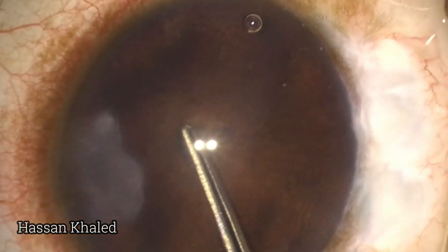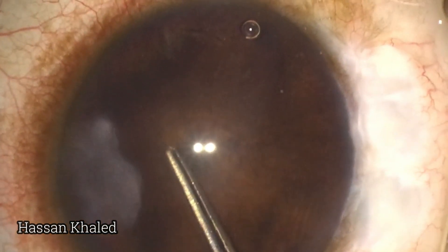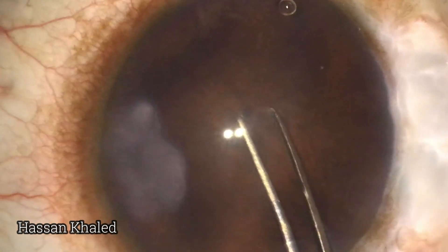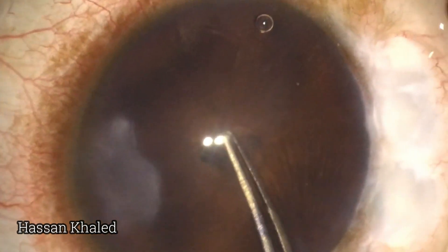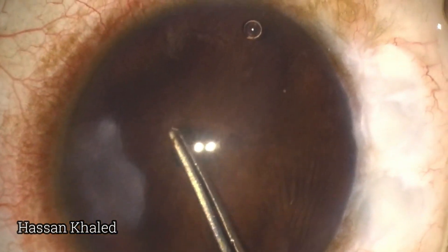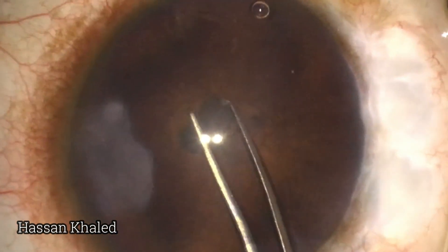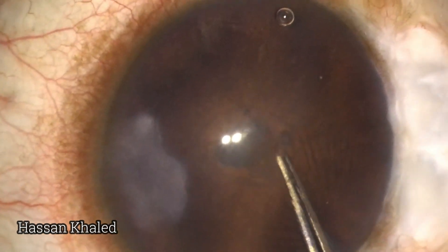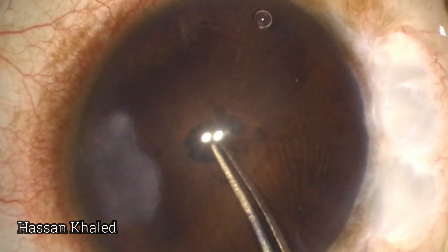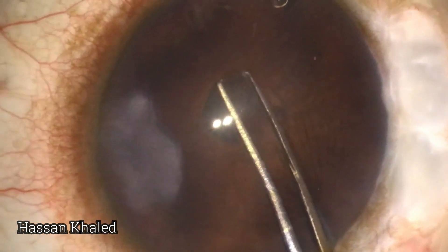Here, micro forceps are used to find the pupil and remove the pupillary membrane in order to enlarge the pupil and allow the use of pupil expander devices.